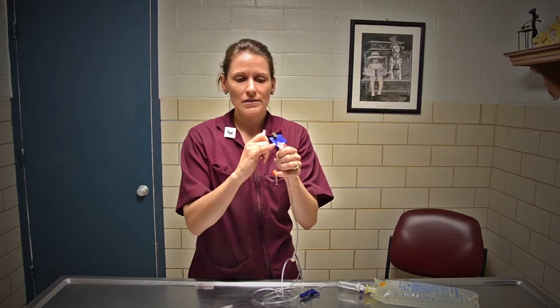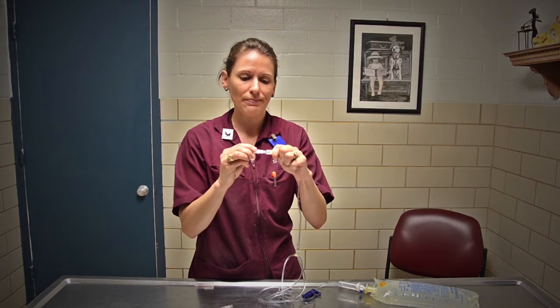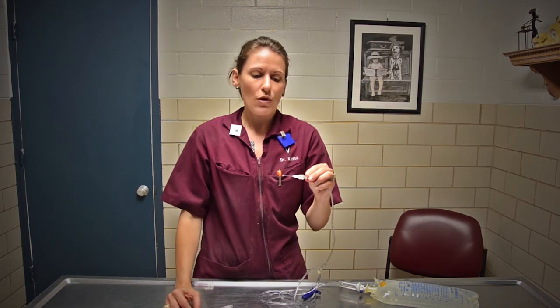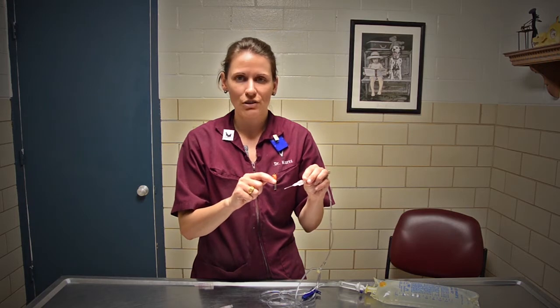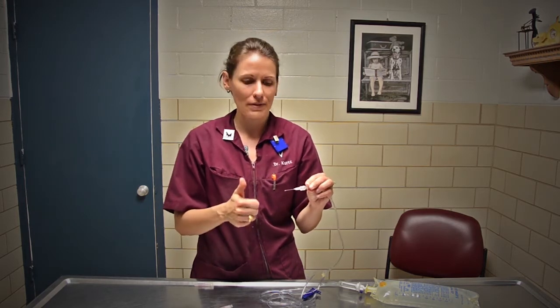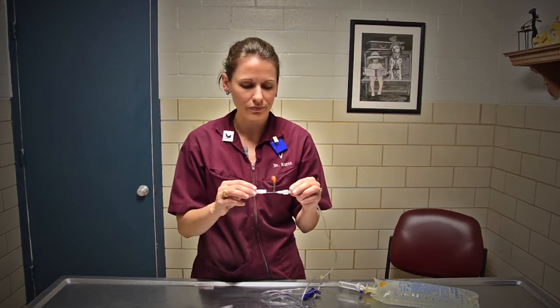This area is sterile on the IV set, and this area is sterile on the needle, so you don't want to actually handle or touch those. You'll place that on, and you can easily pull the cap off. When the needle is open, you'll be able to see the bevel, which is the open end of the needle. This part needs to be up. That's important for administering fluids. It makes it hurt less for each animal.